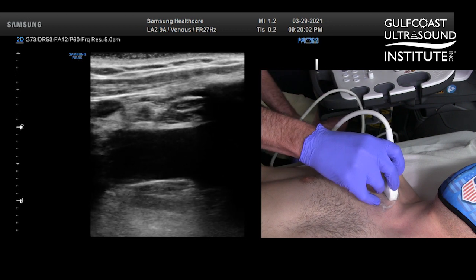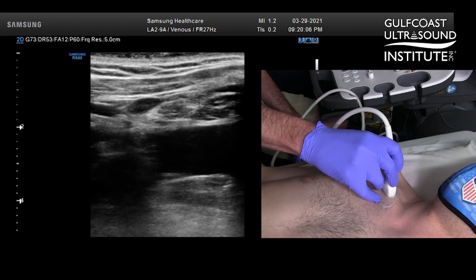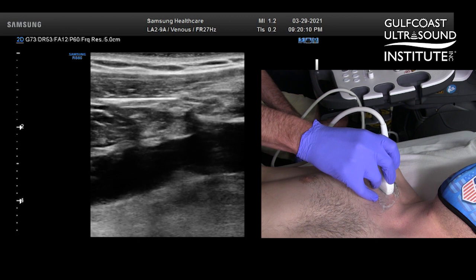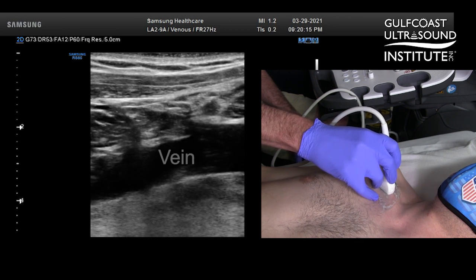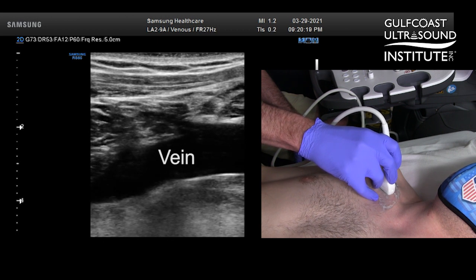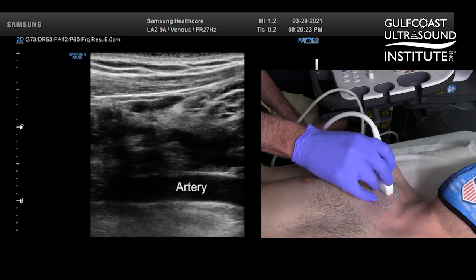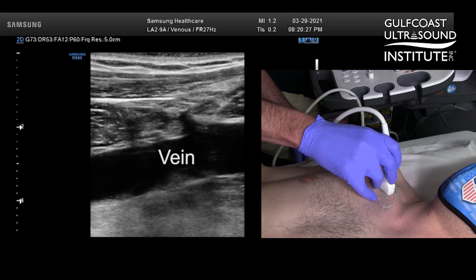My hot tip today is very simple. Just rotate that indicator about 10 or 20 degrees inferior, or toward the patient's axilla, and you'll see at that point you get a nice long axis view of that axillary vein. With that 20 degree rotation, if you tilt or angle superior you'll see artery; slightly inferior, you're going to see vein.